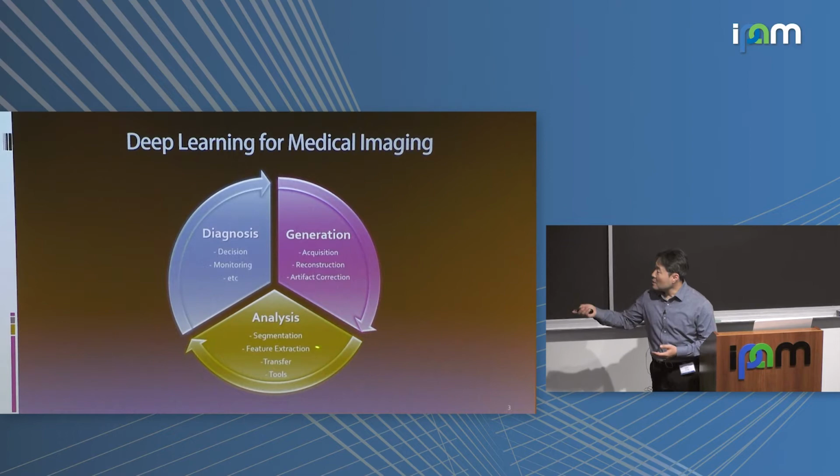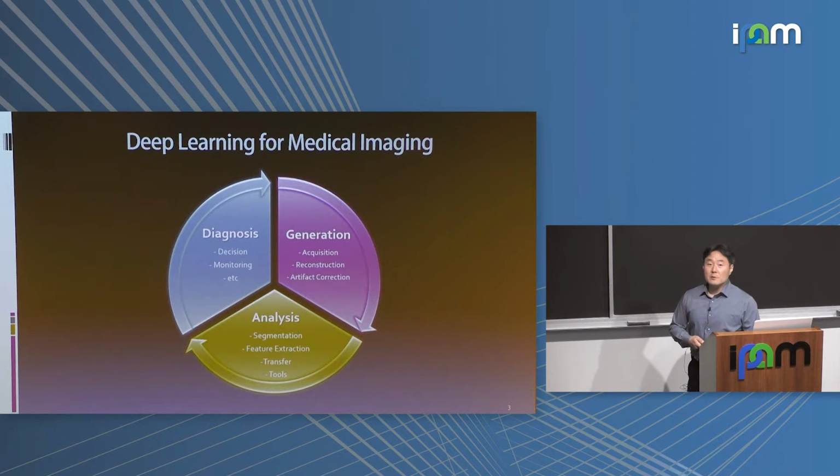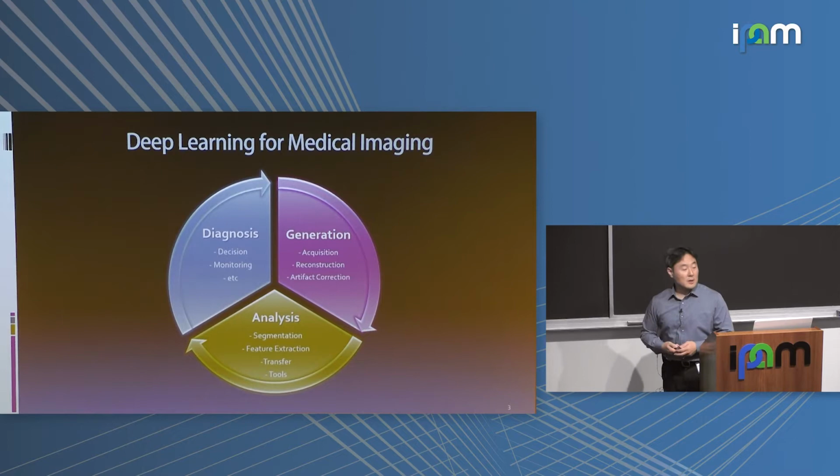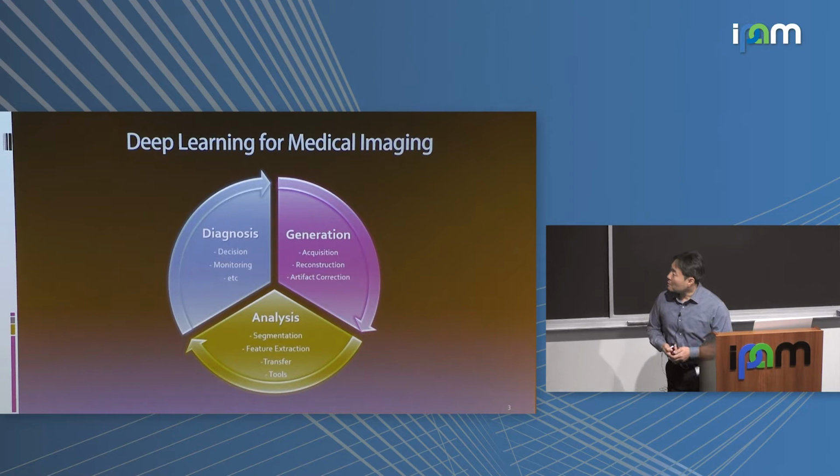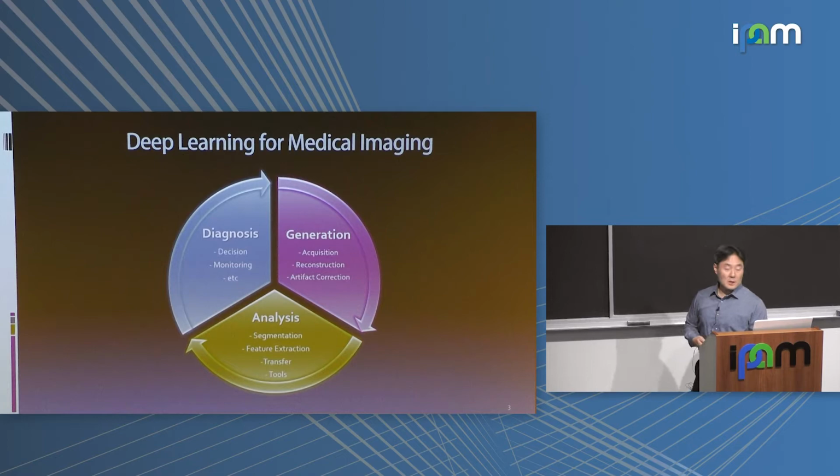After the images have been generated, we can do multiple analyses such as segmentation and feature extraction. Segmentation has been a very difficult task for a long time, but since the advent of deep learning techniques, segmentation has become very robust and applicable to routine medical examination. And finally, the doctors can make the diagnosis by themselves, or the AI can do some diagnosis work for some applications. So all these three components can benefit from deep learning techniques.